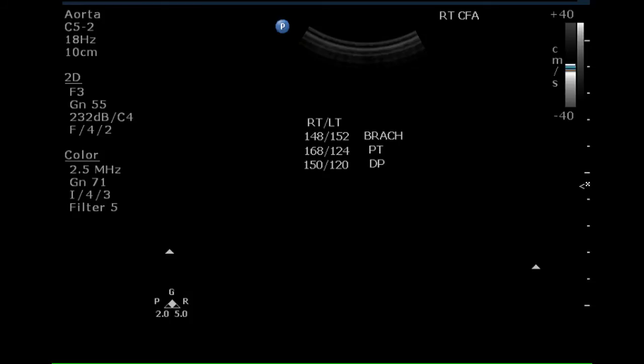The blood pressures at the posterior tibial and dorsalis pedis arteries demonstrate a decreased pressure in the left leg and a normal pressure in the right leg.